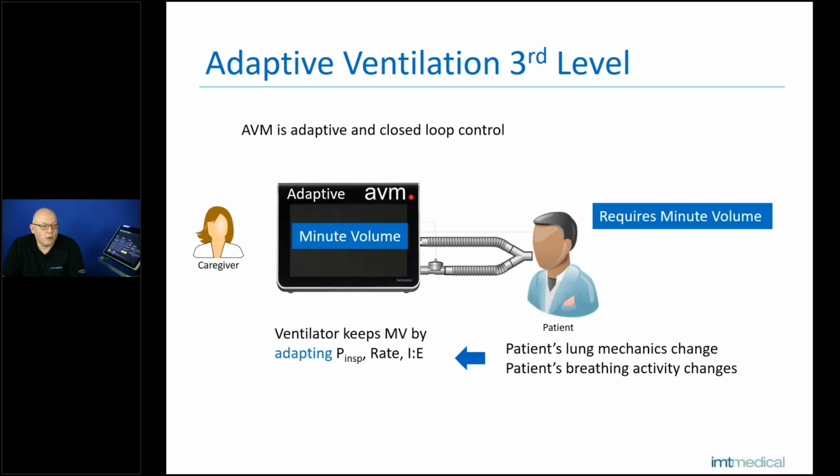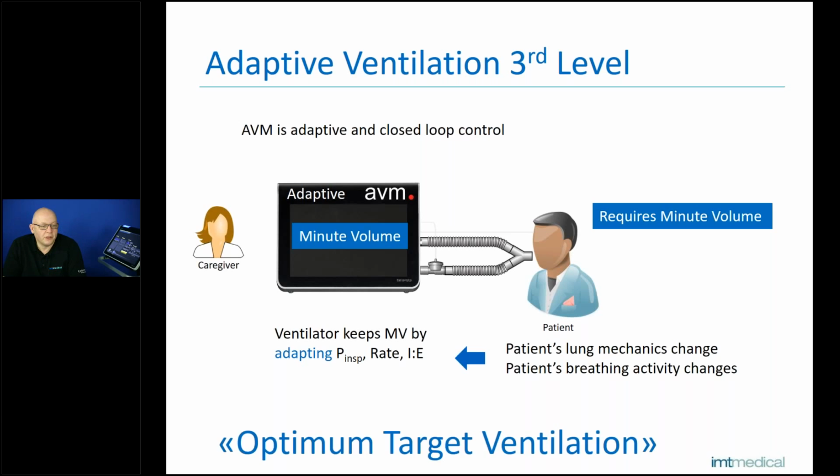So how does this work? Sorry, first we have to give it a name. This is not adaptive target ventilation, this is optimum target ventilation, because the ventilator is always looking for the optimal way of ventilating the patient.